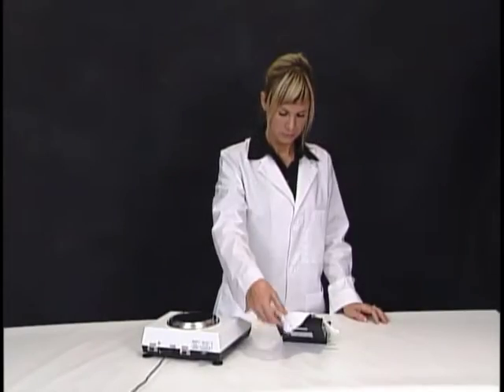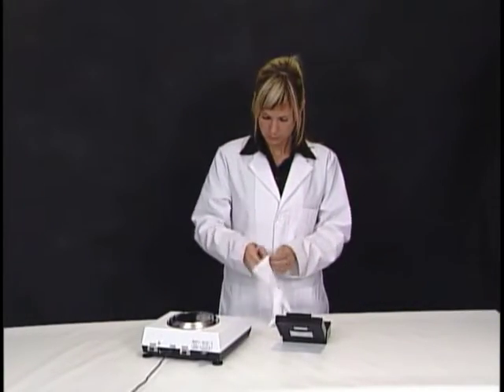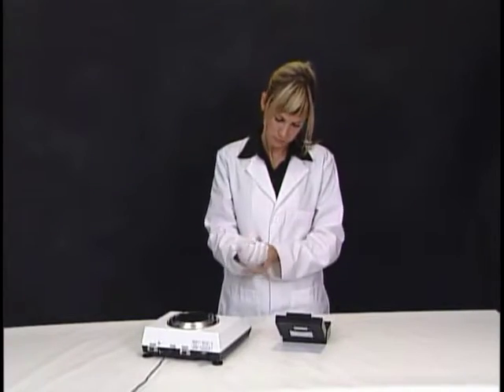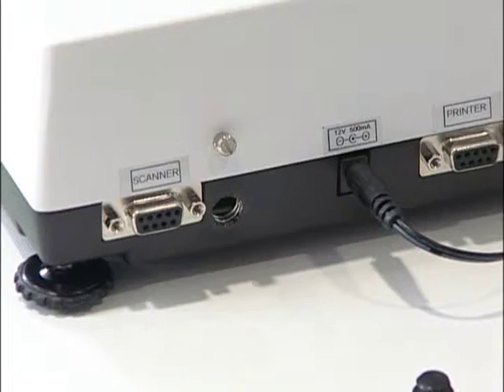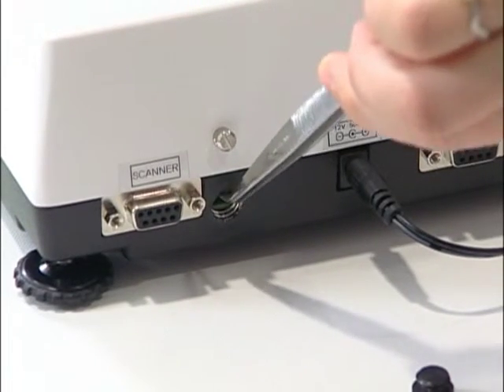Calibration of the DRX4C can be quickly and easily performed with a precision calibration weight. To calibrate your balance, locate the calibration switch at the rear of the balance and toggle the switch to its opposite position.